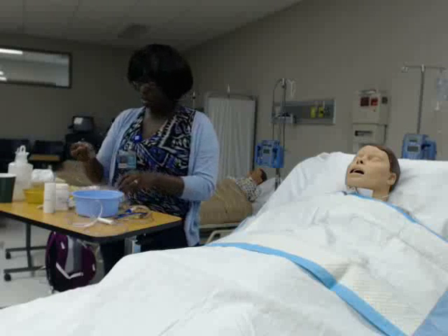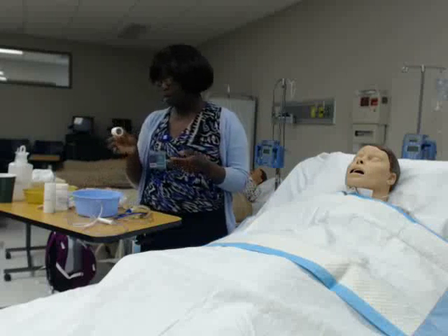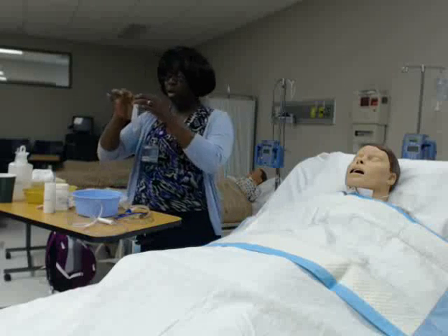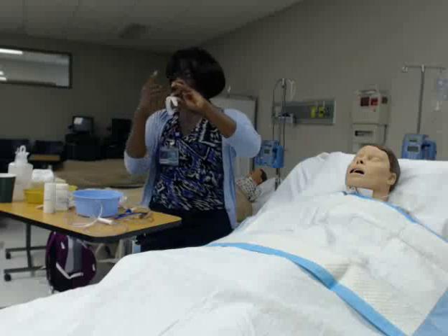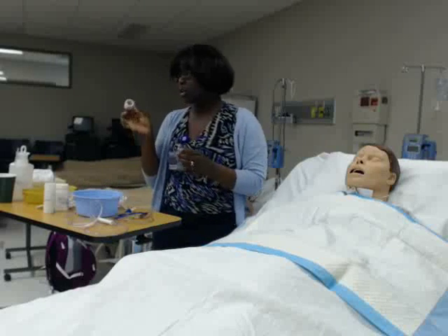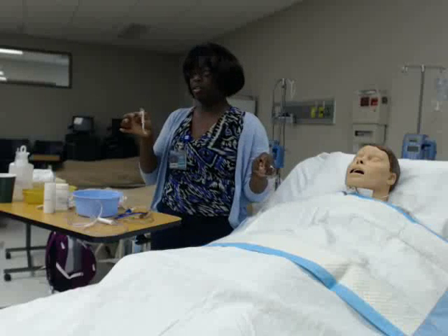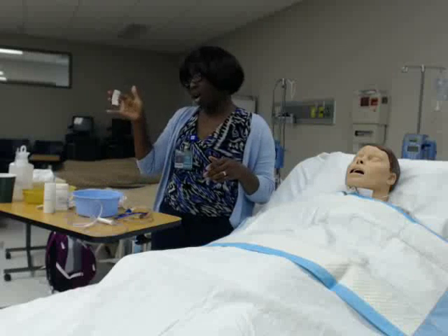You want to have a safety pin to secure the tube to the patient's gown. Before I start, I'm going to prepare my tape first — the tape I need to secure it on the nose. I make little legs with one end of the tape that are nice and even; those will wrap up and around the tubing. I'm also going to get another piece of tape for securing to the gown. I'll fold it over itself and safety pin it to the gown rather than pinning directly — this adds a little extra safety measure.